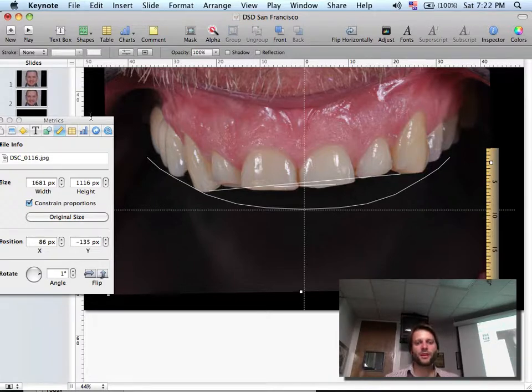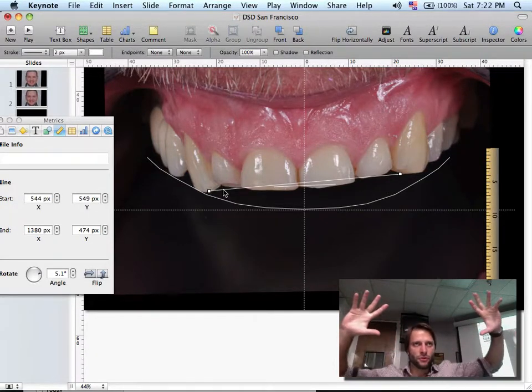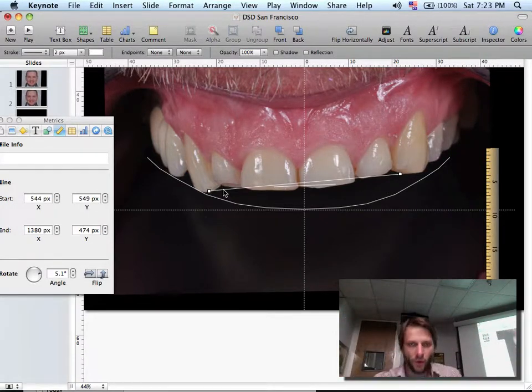Now once you calibrate the cuspids, delete the accessory line from the cuspid so it doesn't bother you to adjust the rest. What do you see? That when I adjust the cuspids, the midline is off and the incisal edge of the central is off. That means there's a difference of the angles of the pictures. That's normal. Remember, the other case I did in the morning was almost perfect. By chance, the pictures were very similar. This one, it's a little bit more off. There's more difference in the angles.